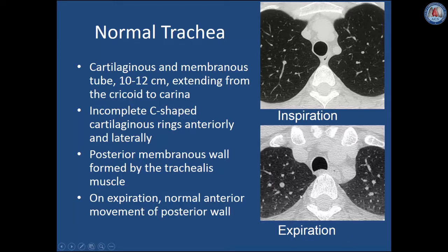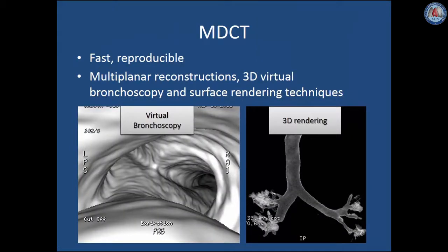Note that lung attenuation is higher than on inspiration due to the lower lung volumes — these are ways to identify an expiratory image. Multi-detector CT is a fast and reproducible method of imaging the trachea, which can be imaged in seconds. That data set can be reconstructed into multiplanar reconstructions, and 3D virtual bronchoscopic images and surface rendering techniques can be generated.